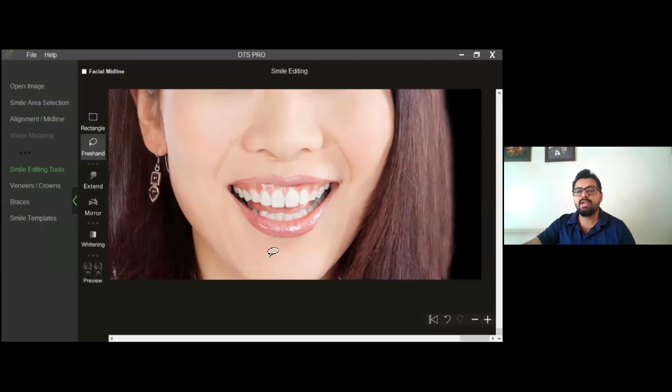I also want to talk here about, since we're talking about simulations in dentistry in general and orthodontics in particular, most of us know Invisalign has got an engine where we can upload the patient's photograph and the engine does the simulation for us. It's based on artificial intelligence, right? I love that engine. I'm inspired by that because it's the quickest way of doing it. So why do you need an additional software for that?